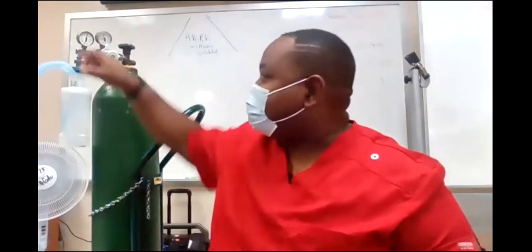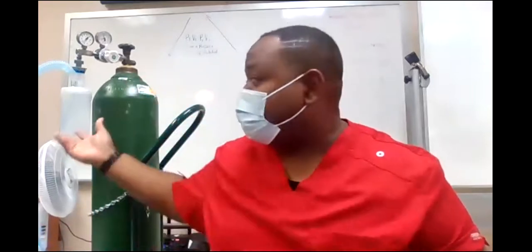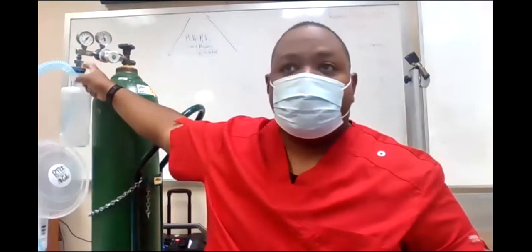Now, quick question. Sometimes the nurses make this mistake. What if the patient doesn't need oxygen, but they have a trach collar? If they have a trach, but they don't need oxygen, then what am I going to have this hooked up to? He's got it on him, but he doesn't need oxygen anymore. His oxygen is great, but he still has an artificial airway. So I still have to do an aerosol setup, okay? Because I have to give aerosol. But what would I have this screwed on to? The mask? No, this part, right here. What do I screw that on to?